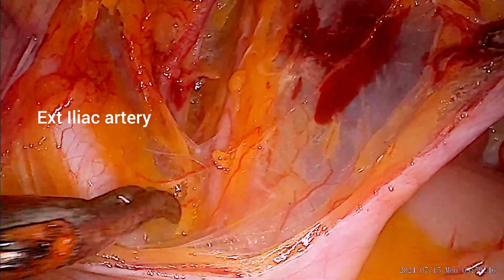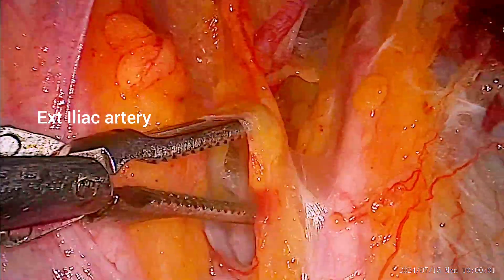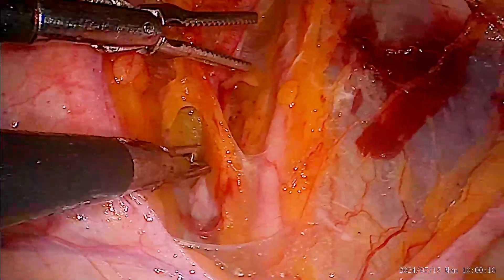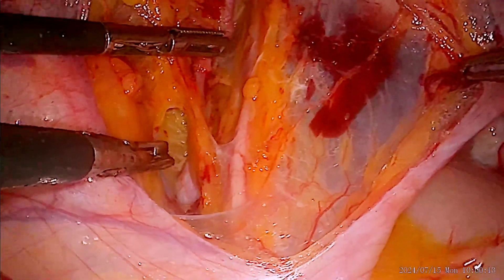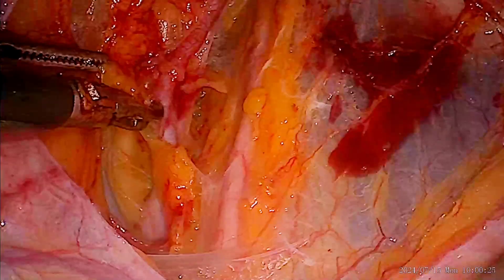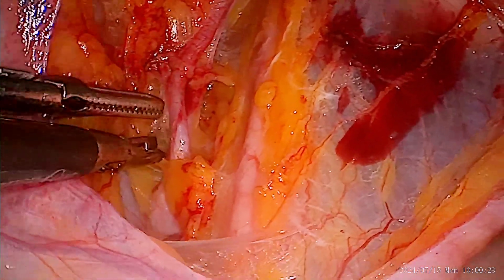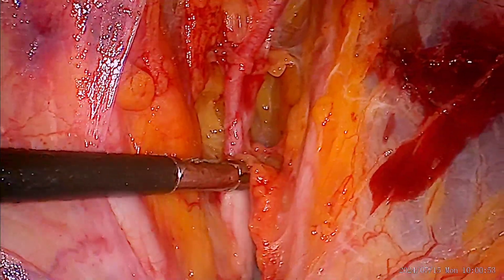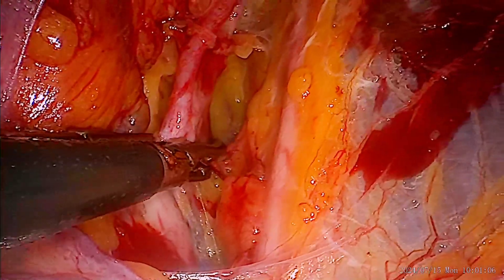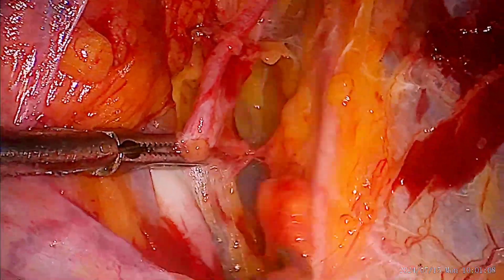As we proceed posteriorly, you can see the external iliac artery. If you dissect further and go a little below, you can see the internal iliac artery and how the internal iliac artery gives rise to the uterine artery.